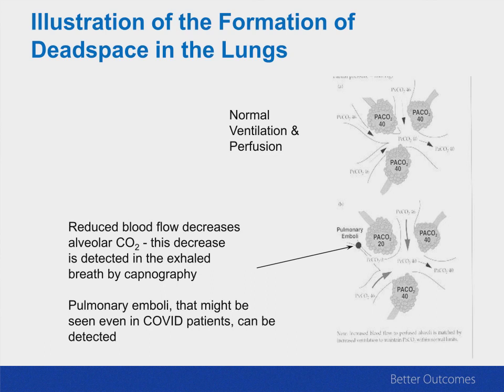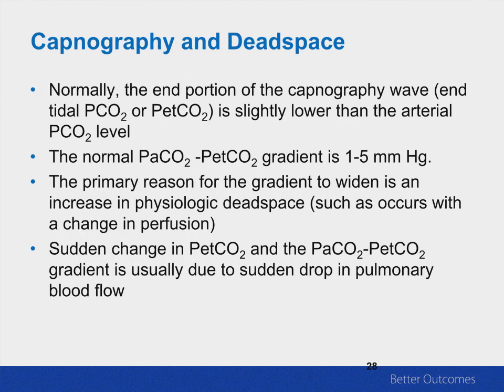And so a pulmonary embolism, as you can see from this slide, blocks blood flow, so there can be no CO2 added to that alveolar area. So the exhaled carbon dioxide level drops. We gave this gentleman a thrombolytic, and within about 15 minutes, his end tidal was back to normal, and he was comfortable. The point being is capnography can help identify changes in what we call physiologic dead space.